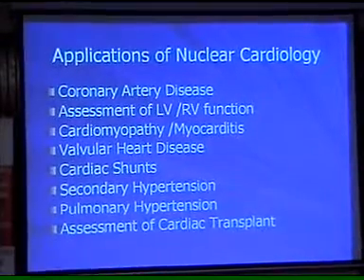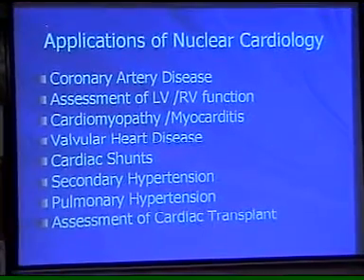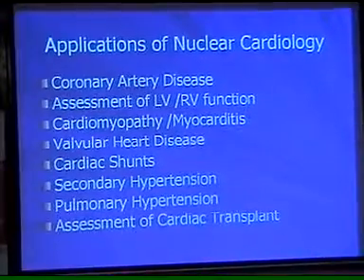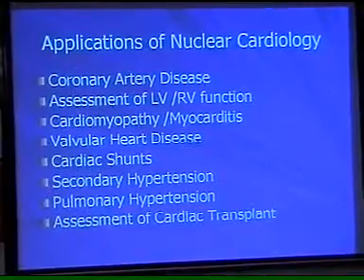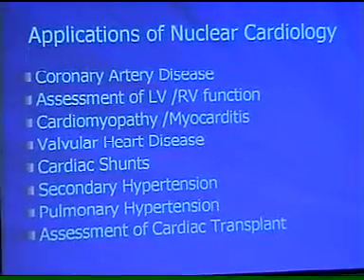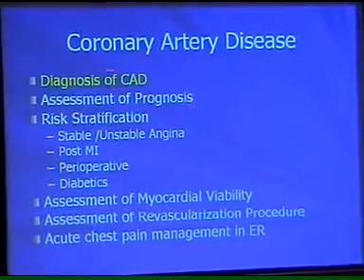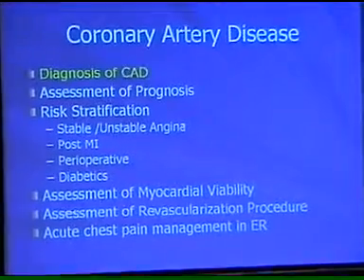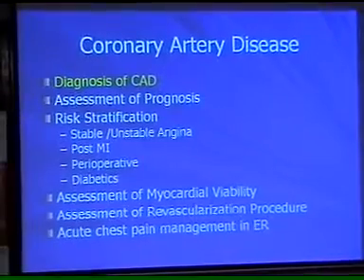The application of nuclear cardiology for stress Thalium is a long list, in fact, but basically it has a much superior role in these two things. For the rest of the things, echo has taken over, even resting echo has taken over all these indications. So coronary artery disease and assessment of LV or RV function, obviously this is the best indication of nuclear cardiology. That's why: coronary artery disease diagnosis, assessment of prognosis, risk stratification, assessment of myocardial viability, assessment of revascularization procedure, and acute chest pain management in the ER room.